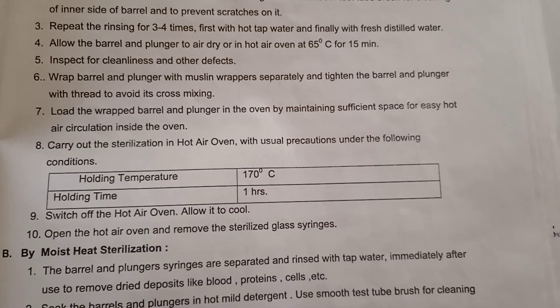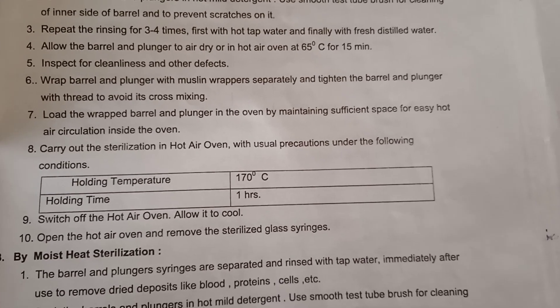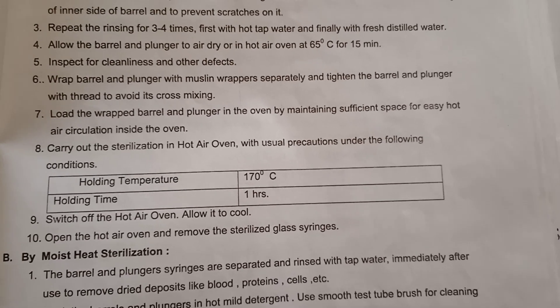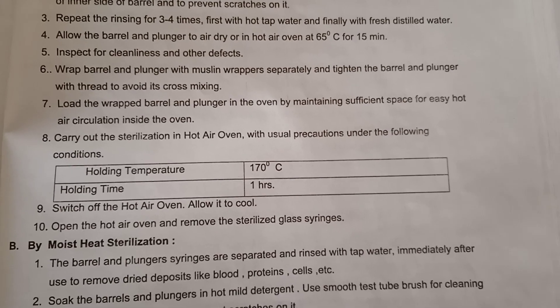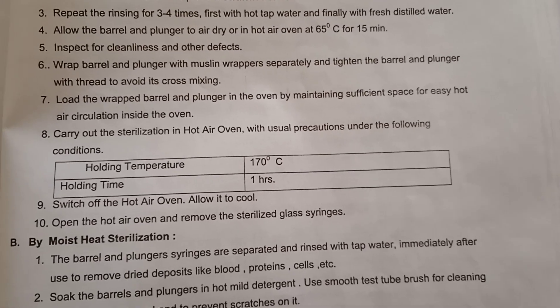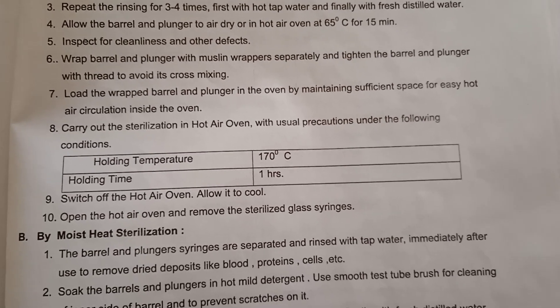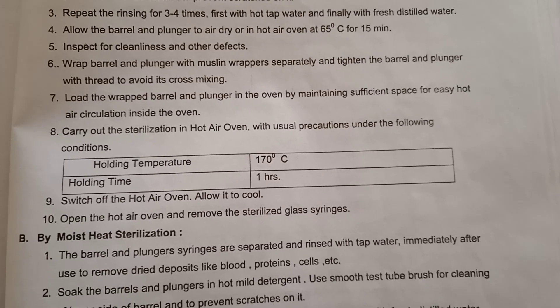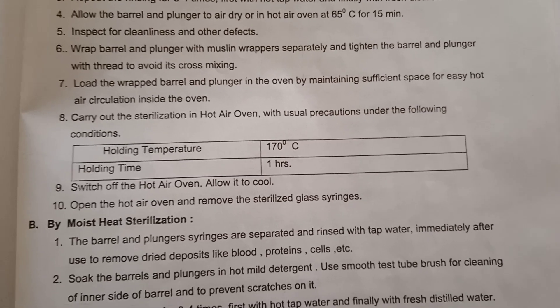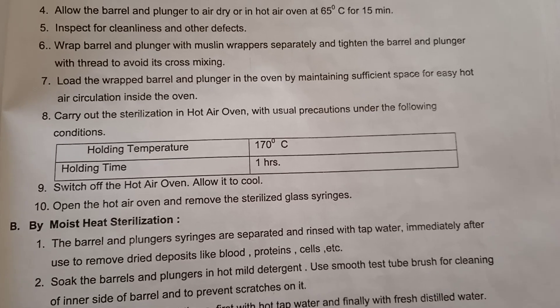Load the wrapped barrel and plungers in the oven, maintaining sufficient space for easy hot air circulation inside the oven. The holding temperature is 170 degrees Celsius and holding time is one hour. Sterilize for one hour at 170 degrees Celsius in the hot air oven. After sterilization, switch off the hot air oven, allow it to cool, then open it and remove the sterilized glass syringes. After sterilization, keep them in a sterile area only.